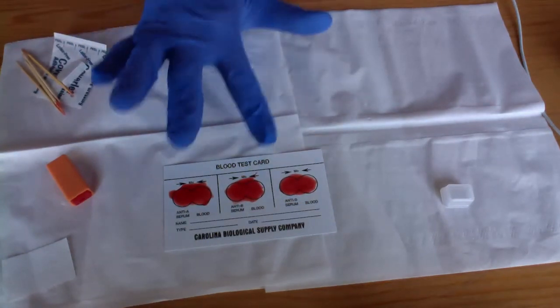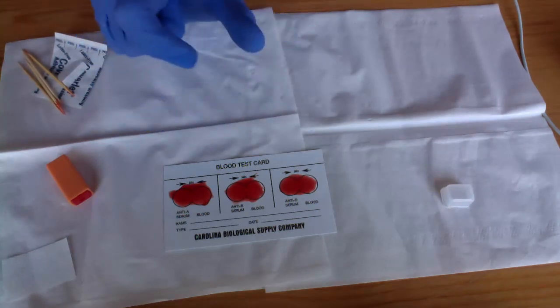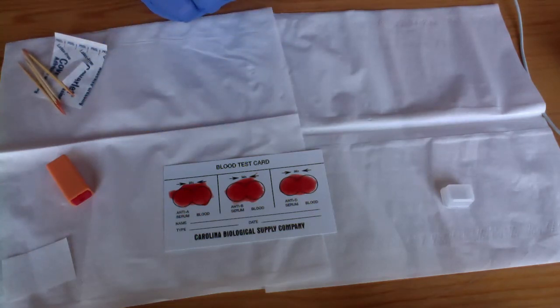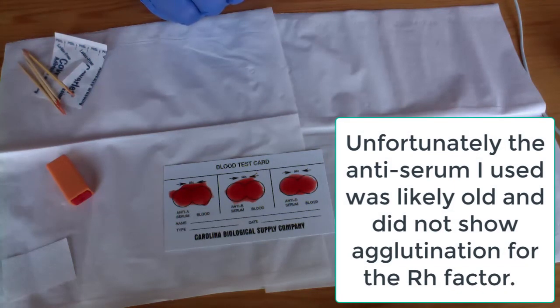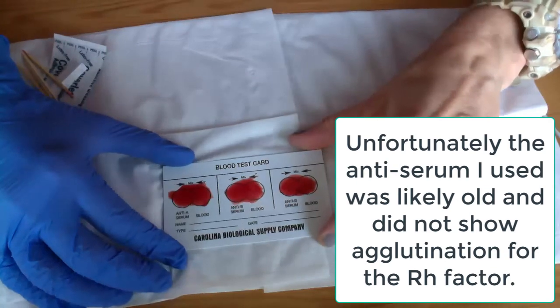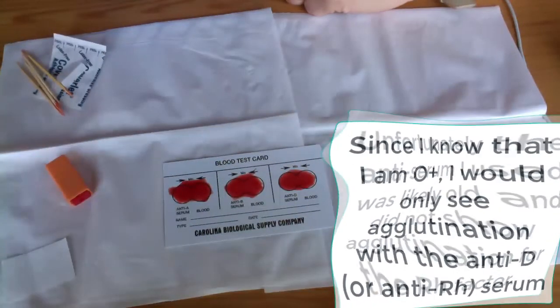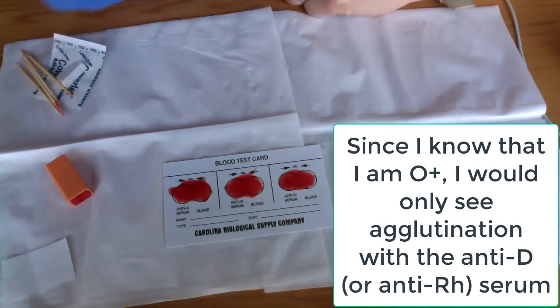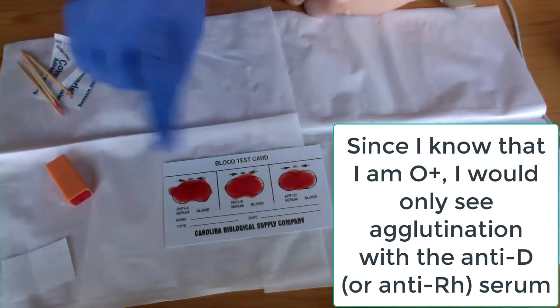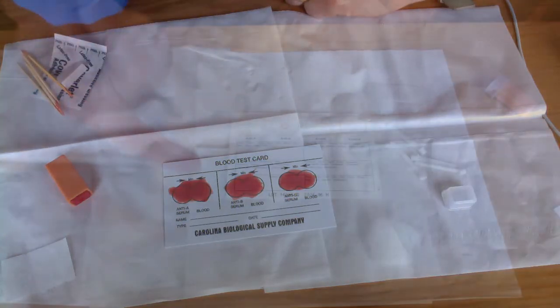So it'll take a little while. I'm going to crop out the section while we're waiting here, because it does take a few minutes before you can see this. But what should happen is that if you have the antigen, the anti-serum drops that we put on this card are going to act like the antibodies.